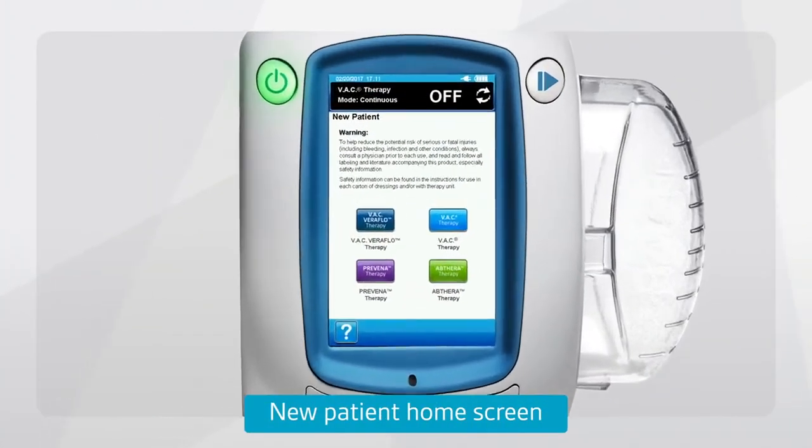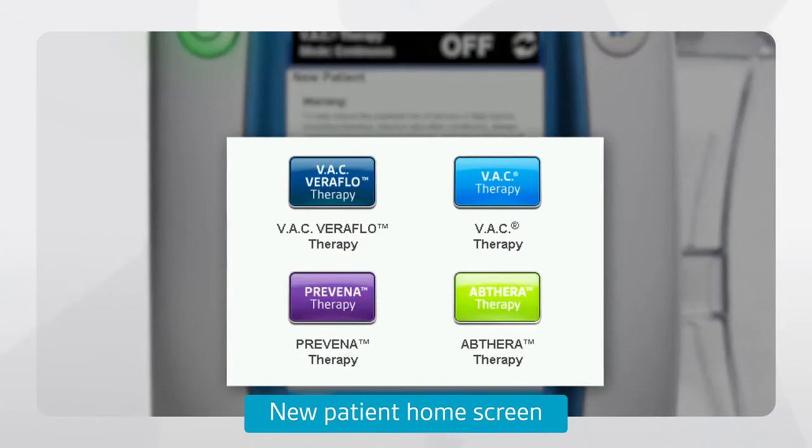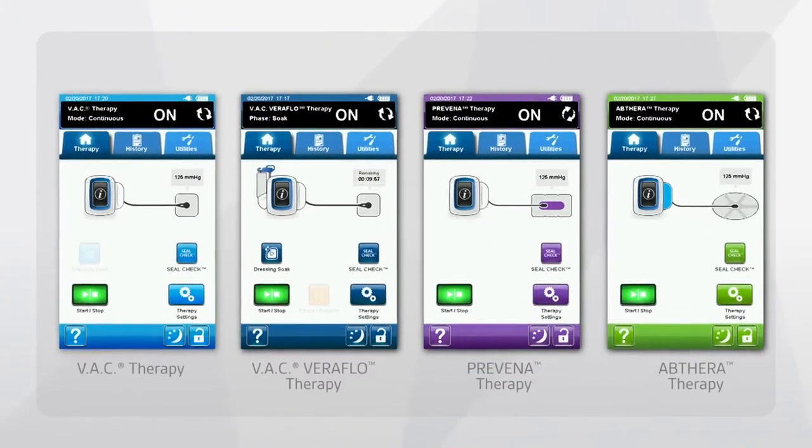The new patient home screen includes four color-coded buttons, one for each therapy. When you initiate a therapy, that therapy's specific color-coding frames the screen.